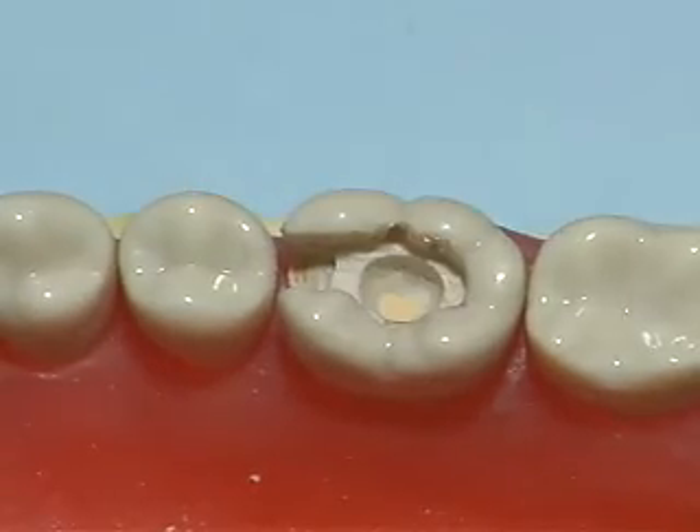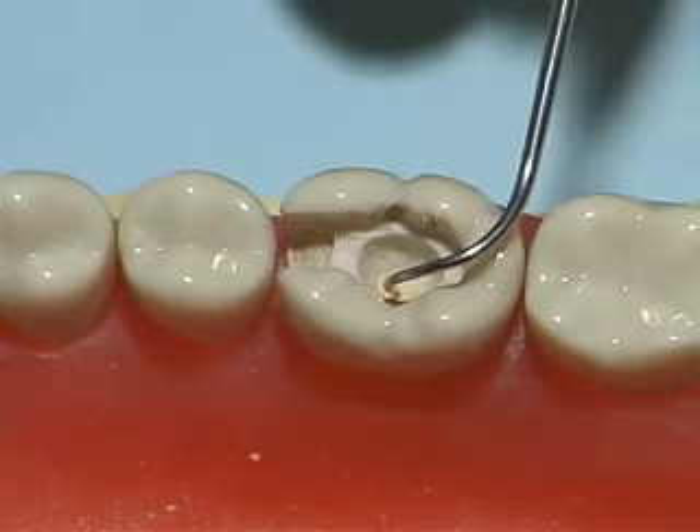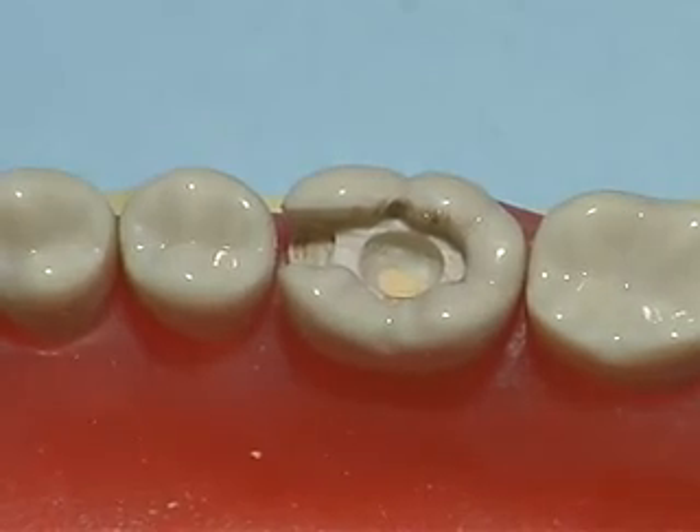After 30 seconds, check the cement with the explorer to ensure that it cannot be penetrated.